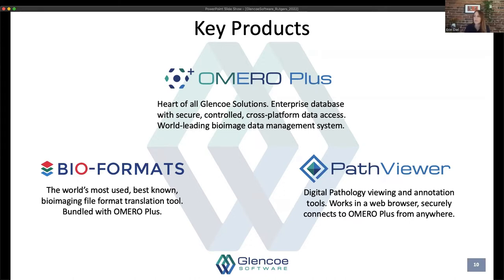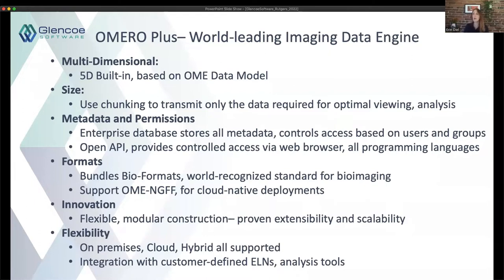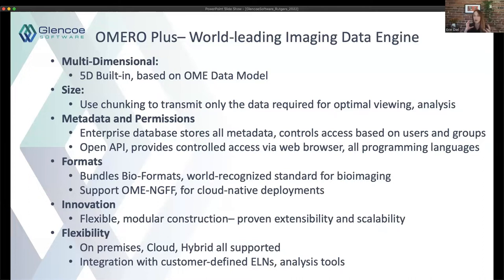How are we addressing those problems? First, the five-dimensional data model is built into OMERO — the OME (Open Microscopy Environment) data model — giving native understanding of 5D datasets. X, Y, Z, time, and tens of channels are all natively supported. Knowing that datasets get quite large, we use chunking to transmit only the data needed. If you're zoomed into a particular part of the tissue or looking at a particular Z-section, we only send that data to the viewer.